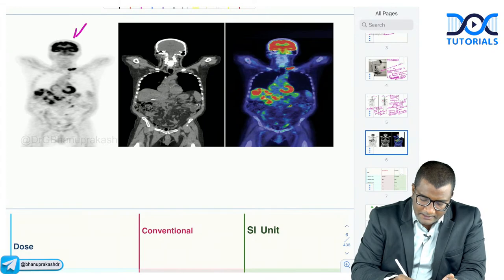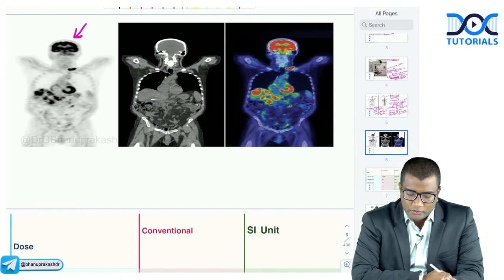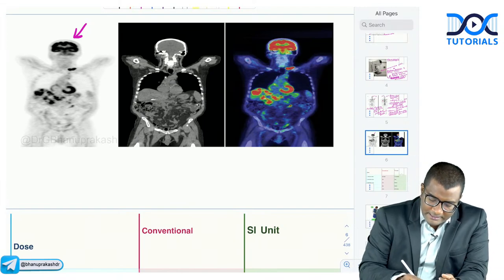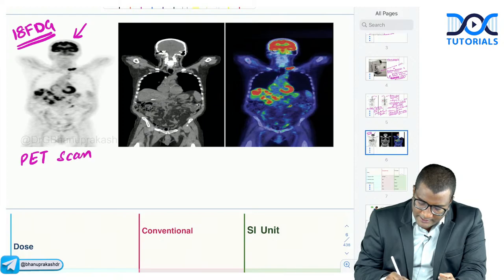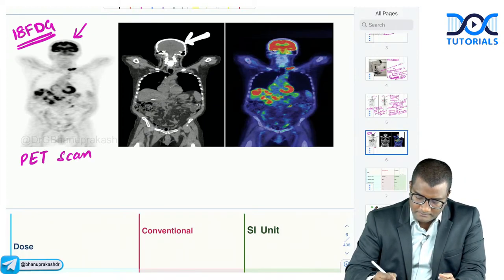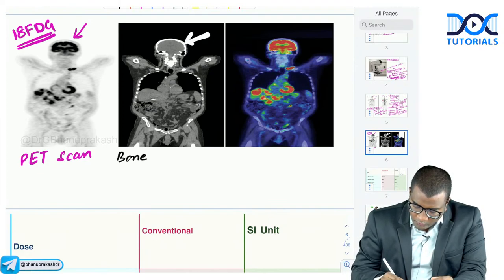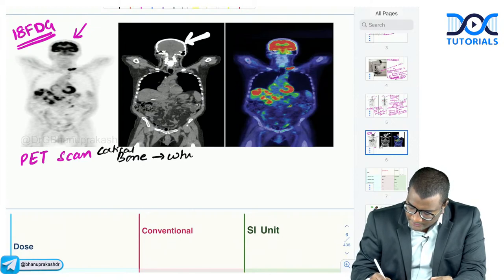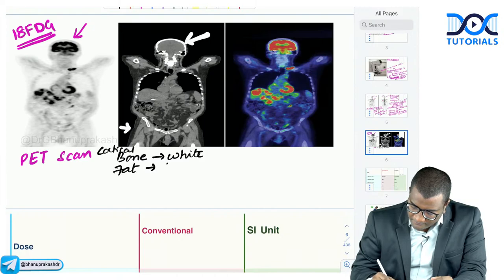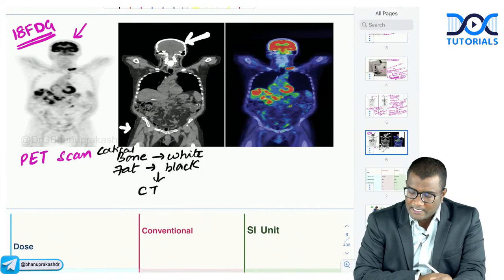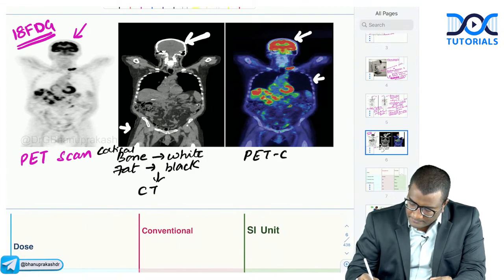Looking at the next image — is this a bone scan or a PET scan? You can see uptake in the neurons, indicating 18-FDG is used. This is a PET scan. Here the bones appear white (hyperdense cortical bone) and the subcutaneous fat is black — this is the CT component. With brain uptake and white bones together, this is a PET-CT: the PET functional scan combined with the anatomical CT scan.